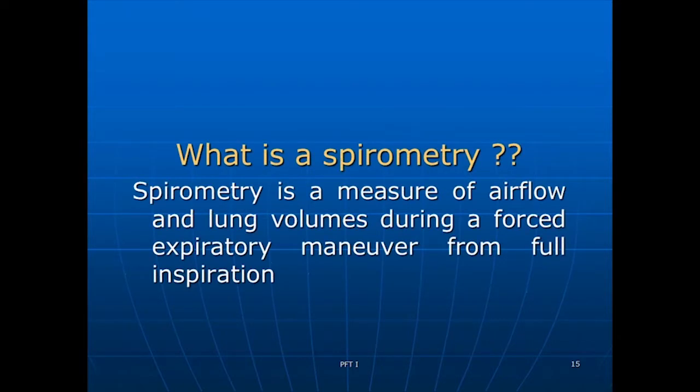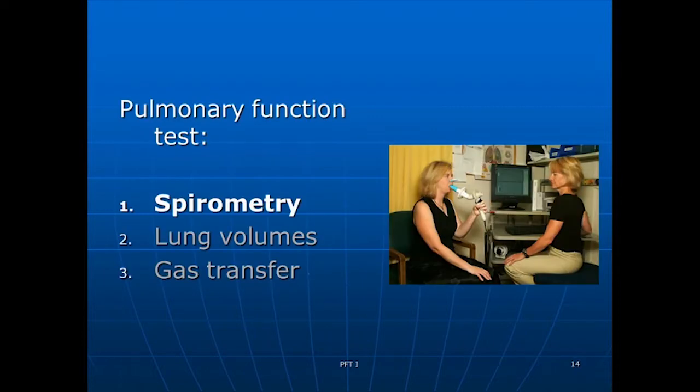So what is spirometry? Again, we talked about this. Spirometry is a measure of airflow and lung volumes during a forced expiratory maneuver from a full inspiration. So it is a measure of flow and volume during a forced expiratory maneuver from full inspiration. This patient is going to take a very deep breath in, and she's in that mouthpiece, she's going to blow out as quickly and as forcefully as possible.